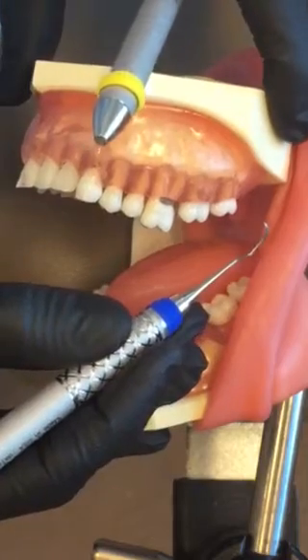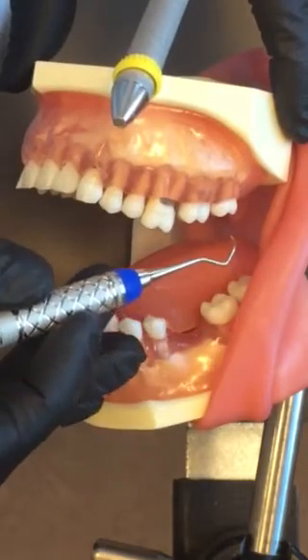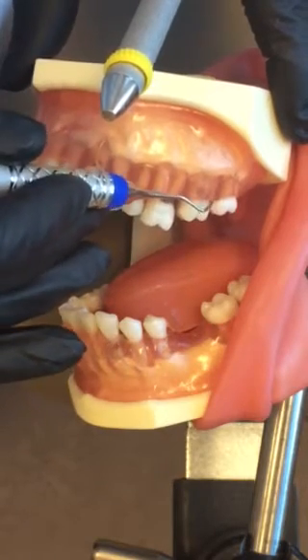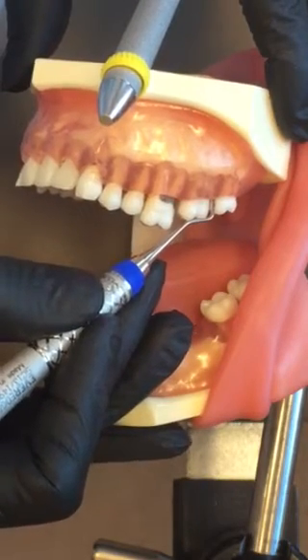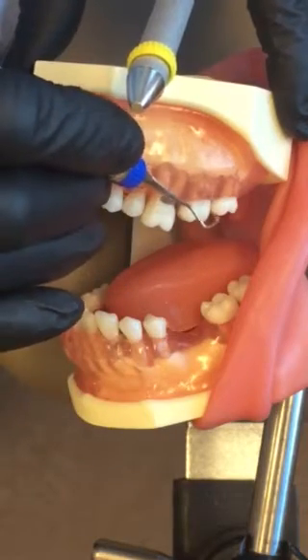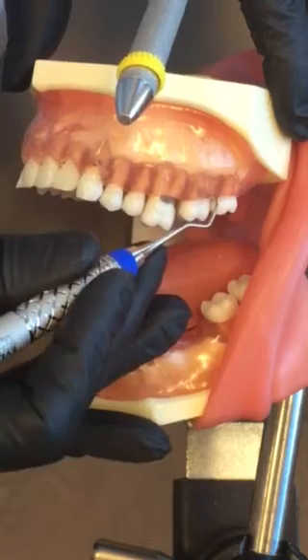If you do have to slide the curette down into a deep pocket in order to get all the way to the junctional epithelium, you're going to need to close the blade, insert, and then establish your fulcrum coming back up to establish a 70-degree angulation. Upon insertion you're at zero degrees — face is flat against the tooth and you slide in, then stand up.